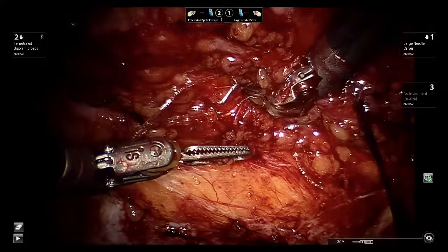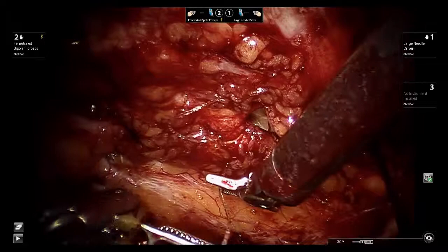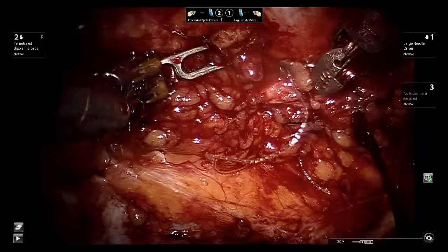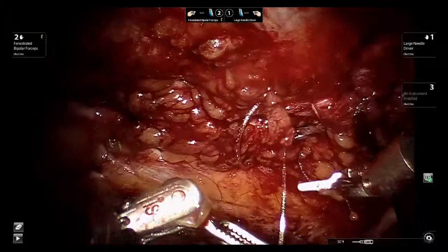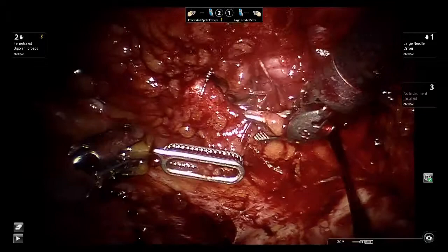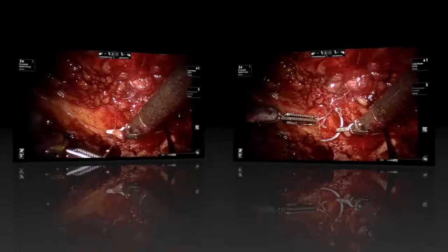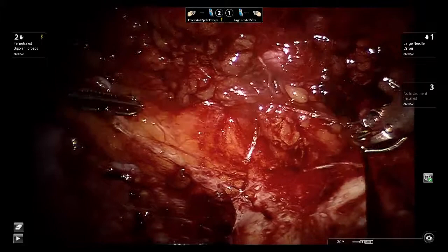The robotic approach allows for very easy suturing on the superior wall, something that would be very challenging to do laparoscopically. At this point, the two sutures from the different ends of the defect are tied together in the middle.